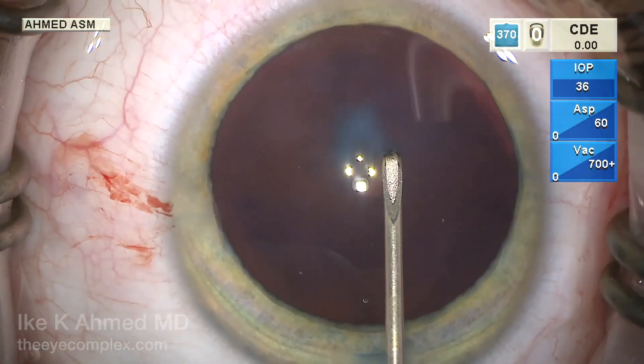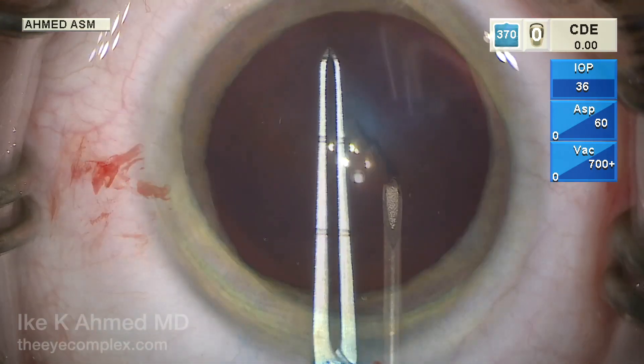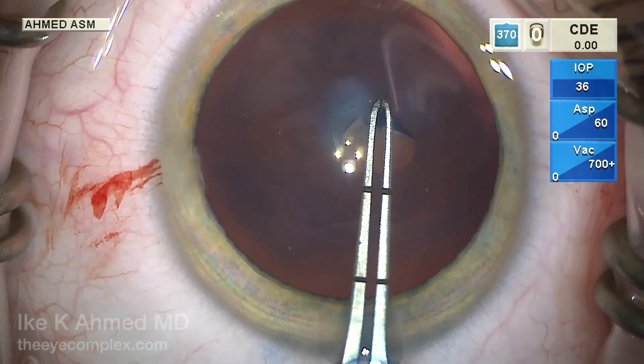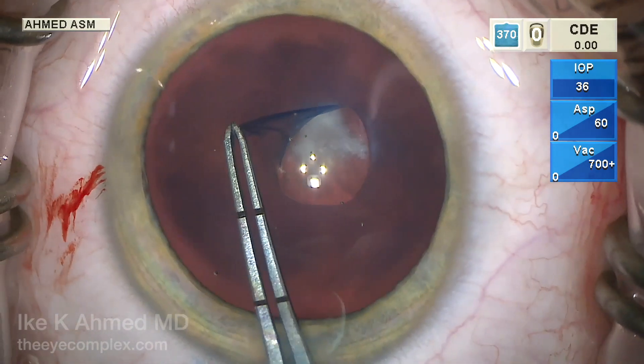Some super viscous Helon V viscoelastic is injected in the anterior chamber to flatten the anterior capsule. Here we have a specially marked capsulorhexis forcep with 2.5 and 5 millimeter markings to help guide the size of this capsulorhexis, which can be hard to control in these very young eyes.